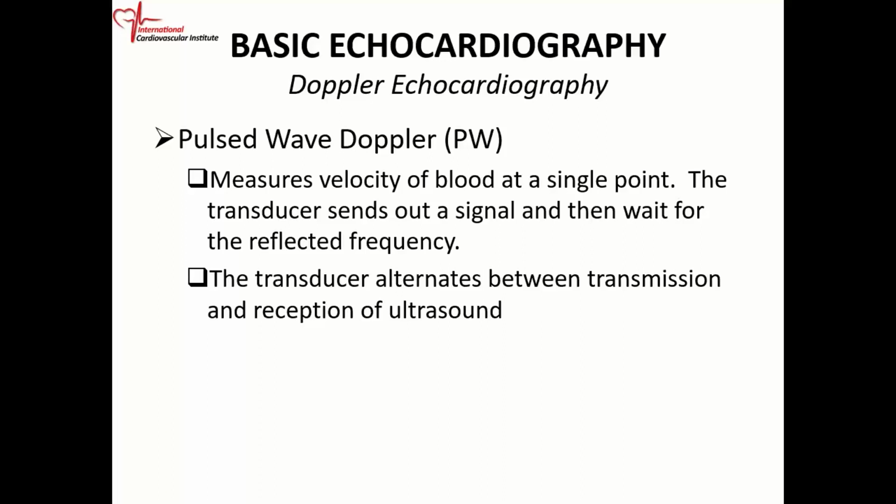We talked about pulse wave Doppler, where when you generate the ultrasound, you send out a pulse of ultrasound and you measure velocity of blood at a single point.